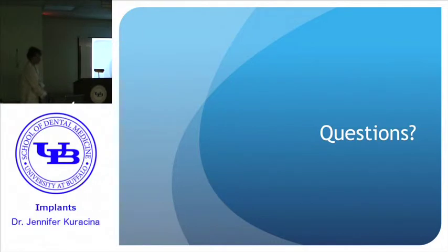We discussed this earlier in the clinical presentation by Joe. And one of the things that's going to be hard to do is to make sure that the restorative entries get placed. Surgical entries should be placed at the time of surgical placement, but it's up to everybody else at the time of the restoration to make sure that there is a restorative entry made. And that's going to be a very difficult thing because we're going to forget it and there'll be a lot of other things that come into play. But every time an implant's restored, one of these sheets should be filled out indicating the type of abutment and all the other information.